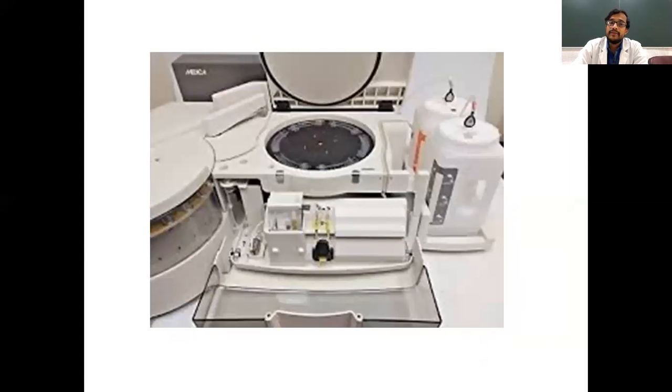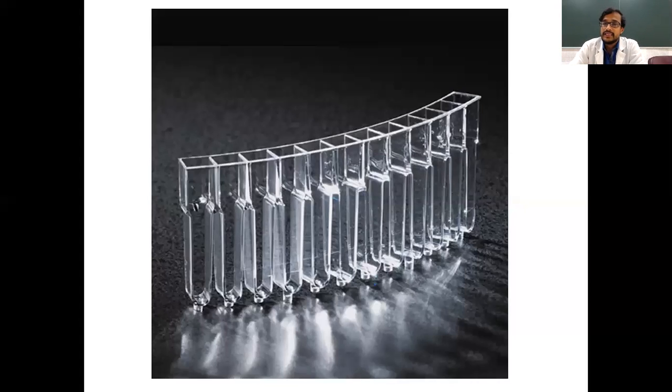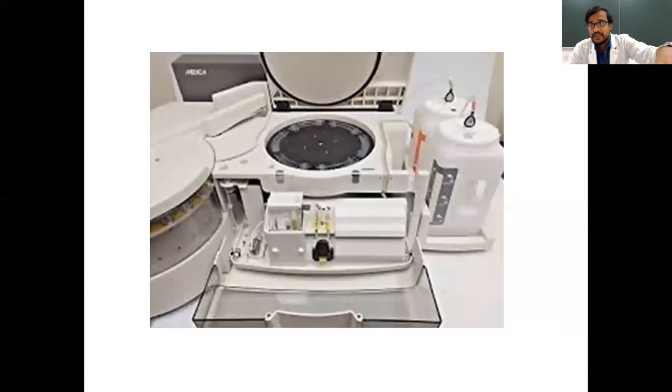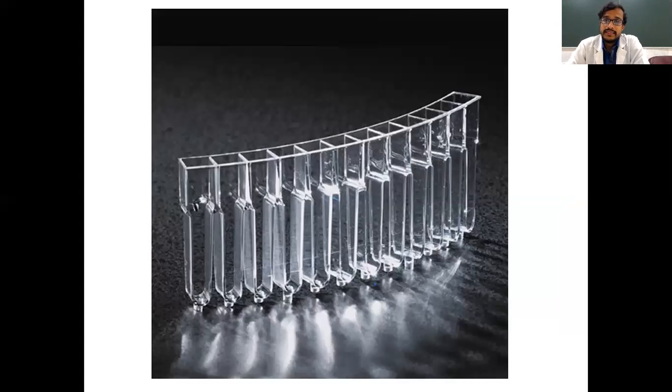Okay. And coming to the other part, here the reaction cuvettes will be placed. That means the reaction cuvettes are the cuvettes which are necessary for the reaction to take place. The analyzer will take the sample and reagent and add in these reaction cuvettes. So here you can see the reaction cuvettes. A piece will be having some 10 cuvettes and some 80 to 100 cuvettes are placed in a fully auto analyzer. So up to 100 tests can be done comfortably. So here you can see the space where these cuvettes are placed. In our Gayatri hospital, 6 pieces can be placed. These are the cuvettes. I think everyone is seeing clearly.